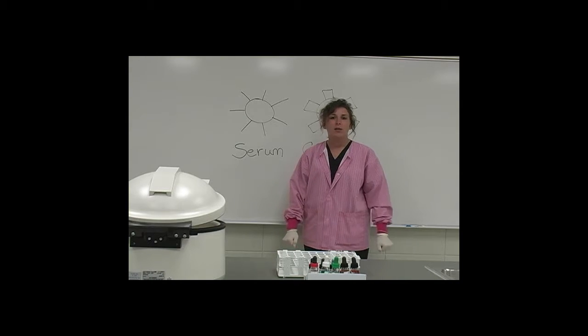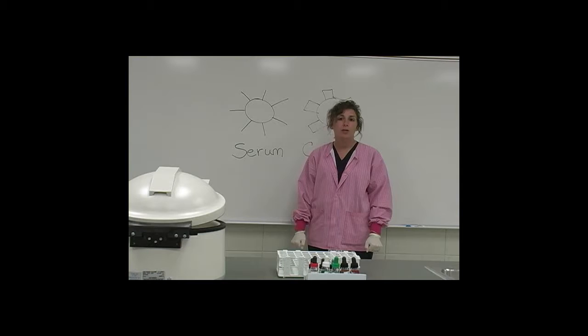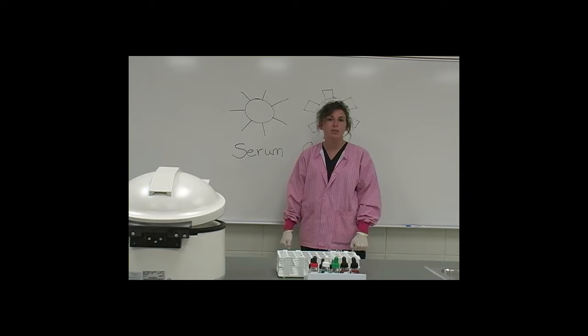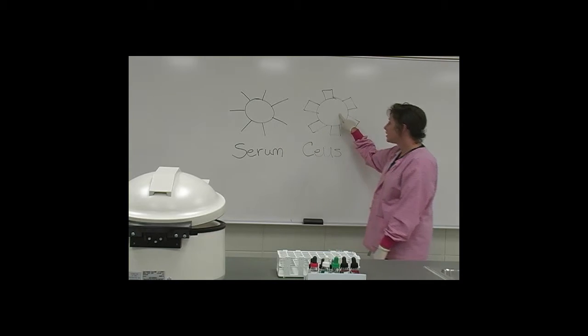Good morning. Today we're going to talk about ABO screening. Everyone is curious to know what their blood type is. And in order to know this and be able to understand the rest of the presentation, it's going to be important for you to understand two basic concepts. And that is going to be the antibody and the antigen.